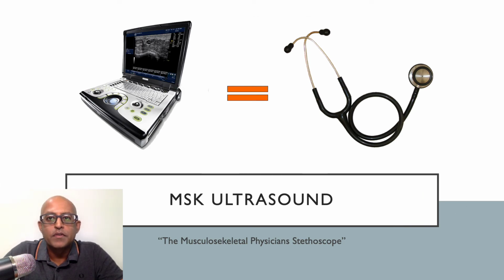Ultrasound imaging is often described as the musculoskeletal physician's stethoscope. It enables us to do rapid, dynamic assessments. It's available both at the bedside and in the clinical setting, and it allows us to do interventions, particularly when patients are in need.